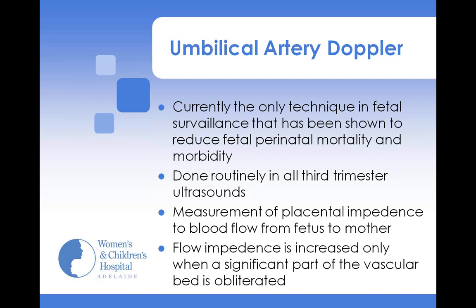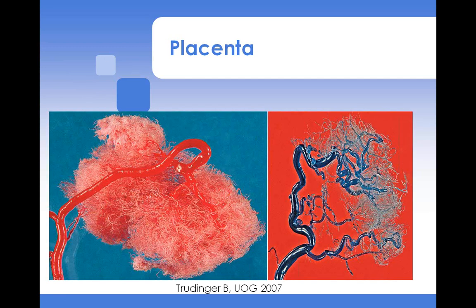I was just encouraged to put this picture in by esteemed Dr. Peter Muller, one of the senior MFM specialists at the Women's and Children's. This is out of one of his presentations. This shows a normal placental vascular bed, and this is one that's been obliterated, one where umbilical artery Dopplers were abnormal.